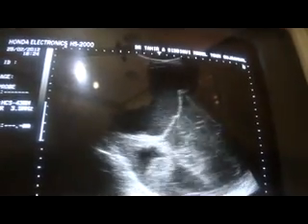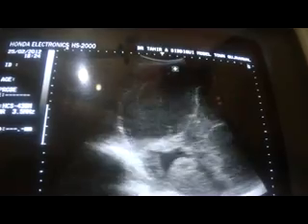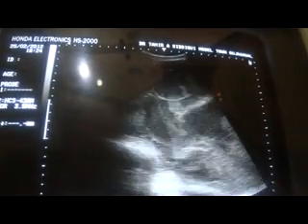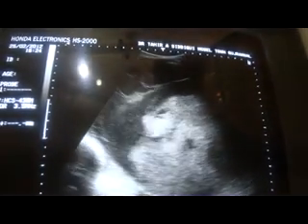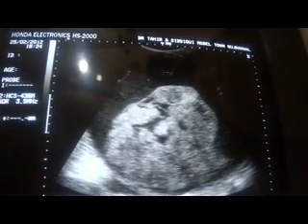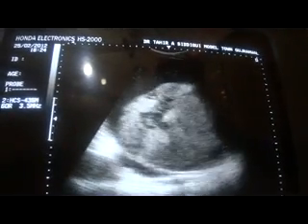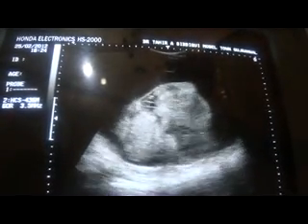So there are numerous, multiple septations within this cystic area, and the cystic area is very well demarcated. See its outer surface. Okay, we will study it later. Now you see there is another globular area at the posterior margin, at the posterior end of the cystic area under study.